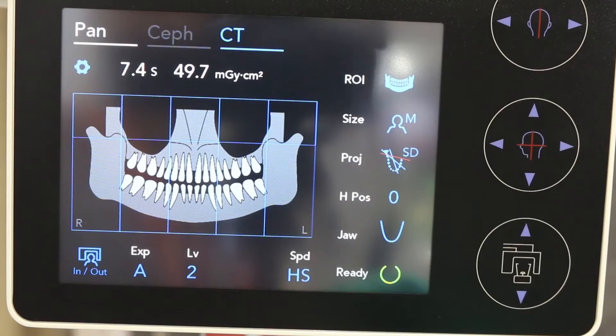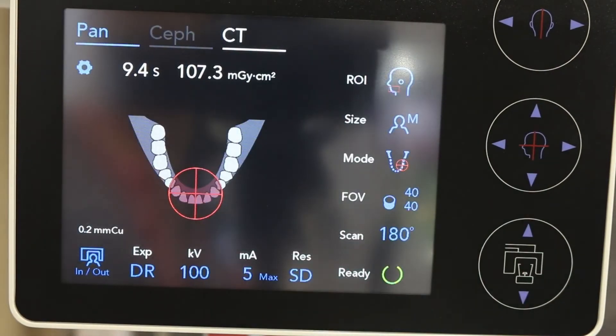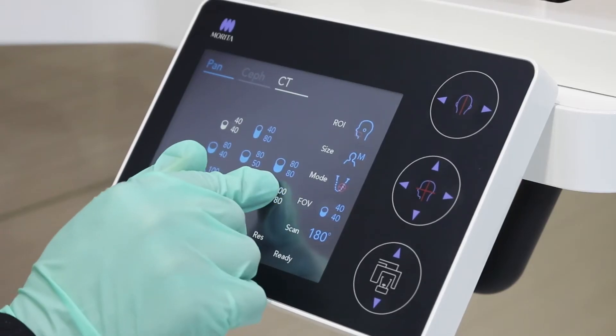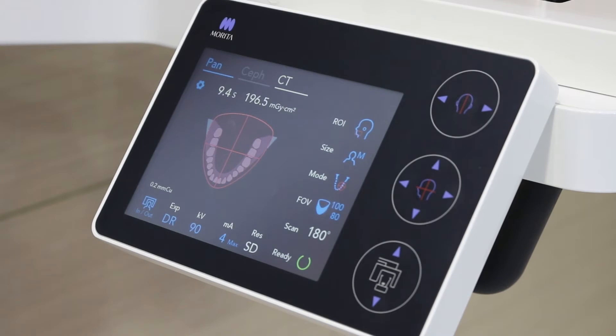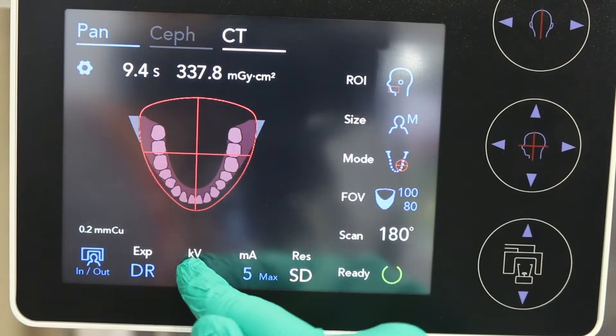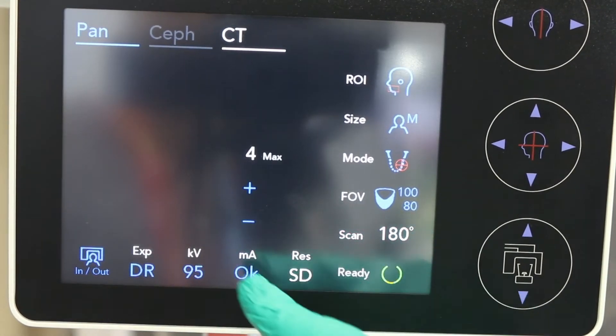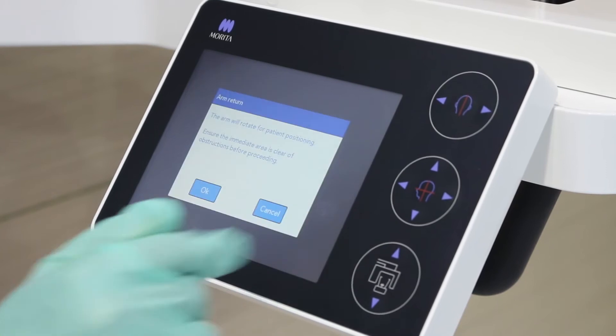First, select CT on the touch screen control panel. Now select the field of view required. In this case we will select the 100 by 80 mm full arch field of view. Set your desired exposure settings for KV and MA on the touch screen control panel.